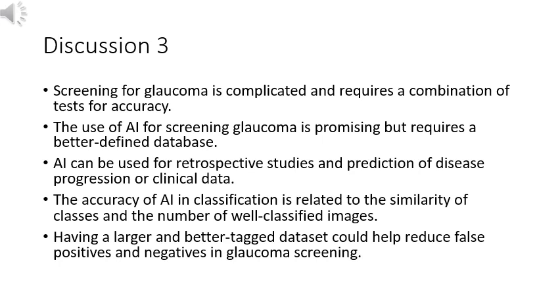In a recent review, Schmitter-Firth et al. indicate the limited role of CFP for advanced stages of AMD compared to OCT screening 29, but for a general screening platform it may make sense to start with color fundus photography due to cost considerations. Also, AI has detected patterns that are invisible to the human eye in CFP, such as gender, age, and smoking status. Detection of advanced AMD in retinal fundus images should therefore be studied.